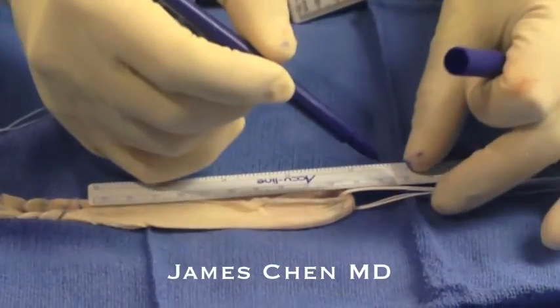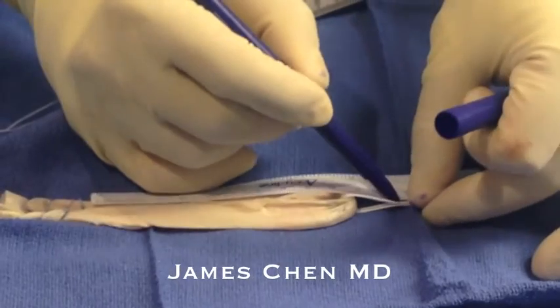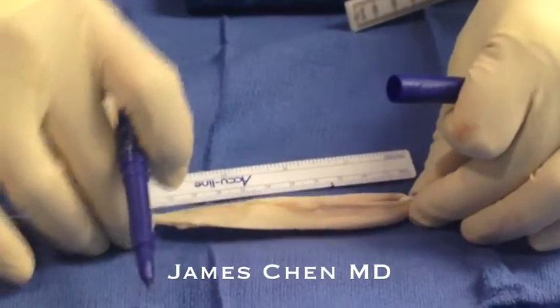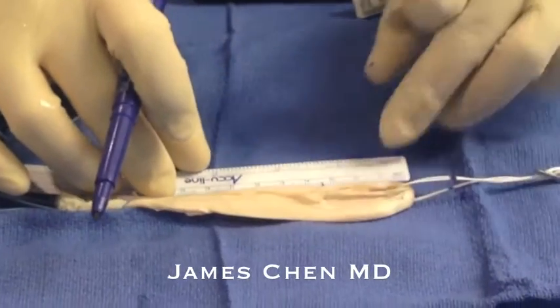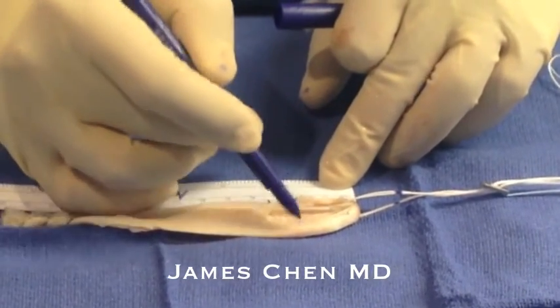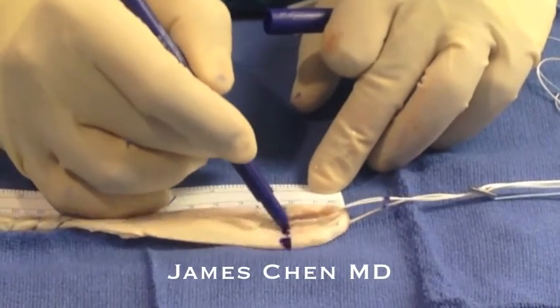Here I am with a marker. I am marking the tightrope the appropriate length so I know when the button is expected to flip on the lateral femoral cortex, and I also mark the appropriate graft length so I know when to cease pulling tension on the tensioning sutures.